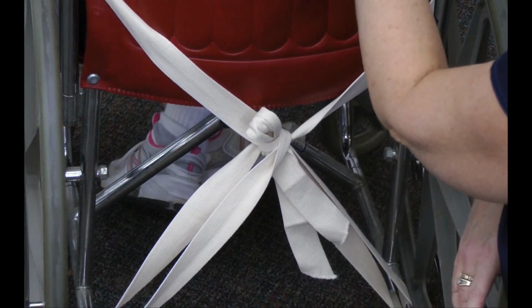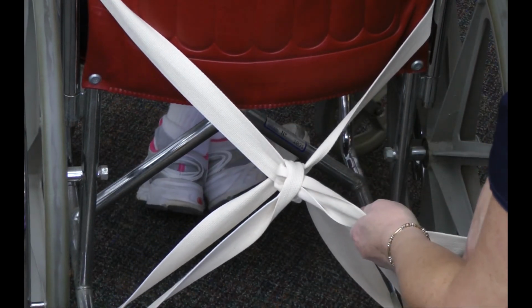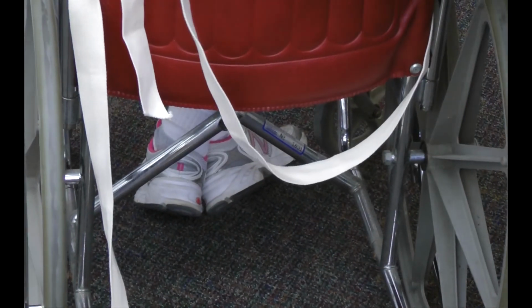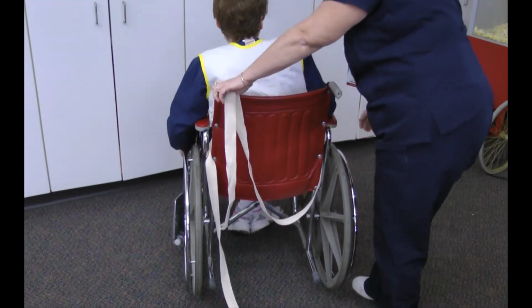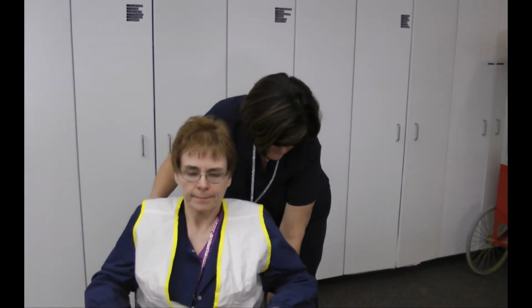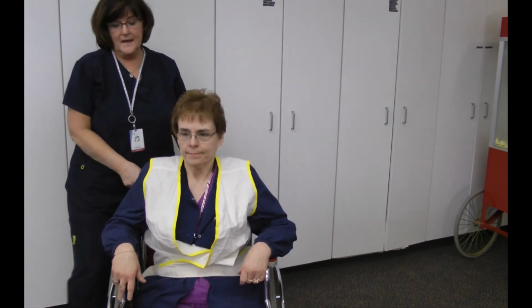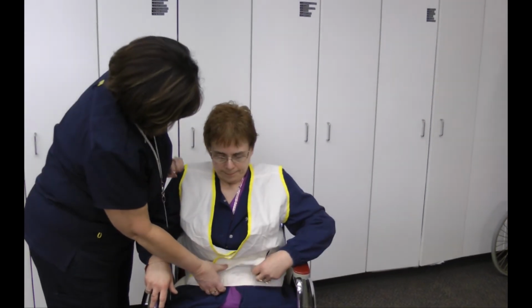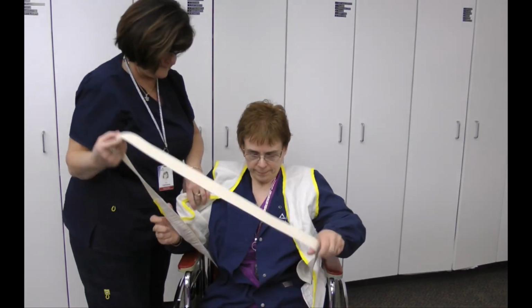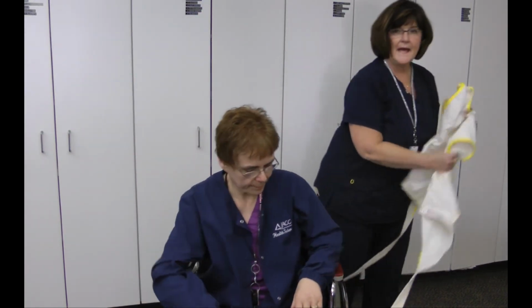Go ahead and lean forward, Melissa. Would that keep you in your chair? Sure. Okay, again, you pull both of these. One pull, it has to release so we could get her up if there was a crisis or a problem. Go ahead and unlock that one. So that's a vest restraint. There we go. A vest restraint, waist restraint, and wrist restraints. Check every 15 minutes and release every 2 hours.